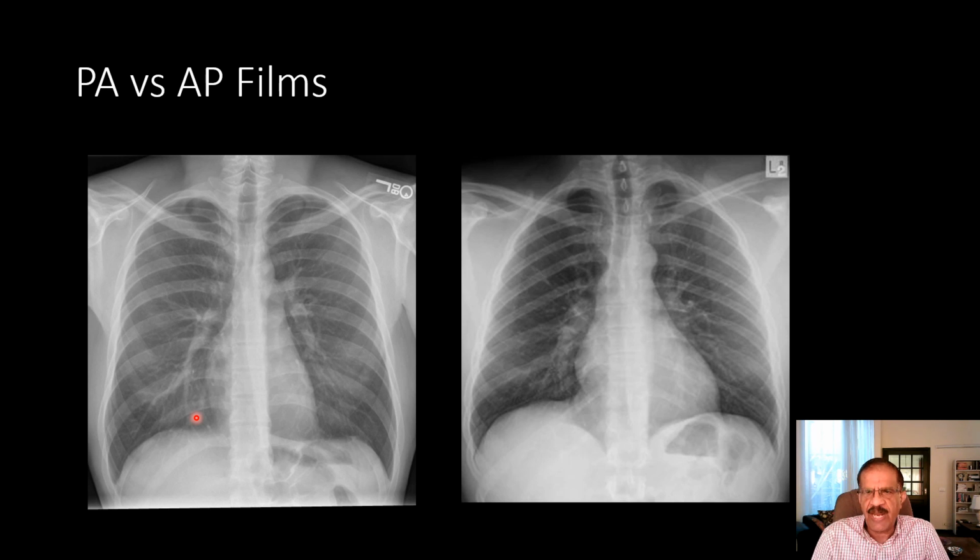So if you are shown an X-ray, first spend a few seconds to make sure that everything is normal. And if you see an abnormality, once you have read the X-ray to yourself, then start describing the abnormality after just making one statement. This is an X-ray chest, PA film, and this shows a particular opacity if there is an opacity, right? Do not spend too much time describing normal things, because the examiner wants to know if you have picked up the abnormality or not. After maybe just one sentence, you straight come to the opacity.